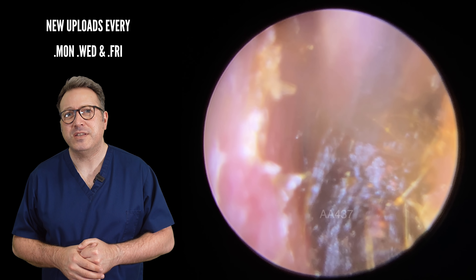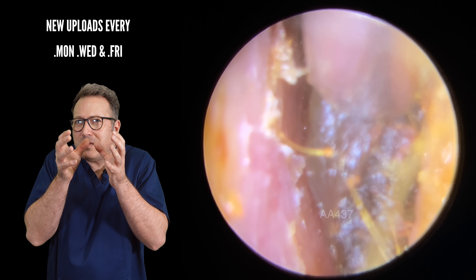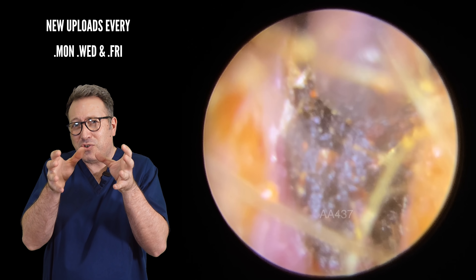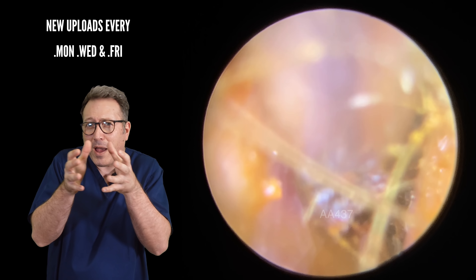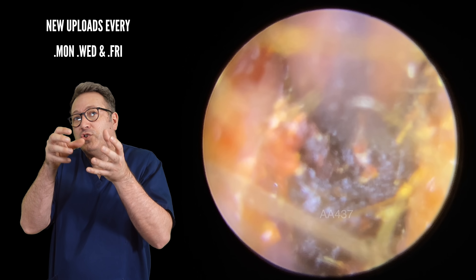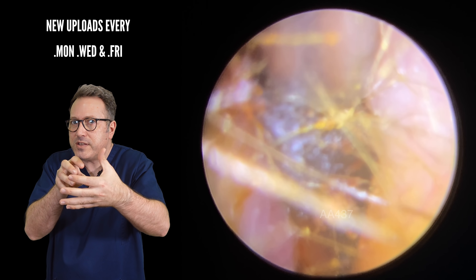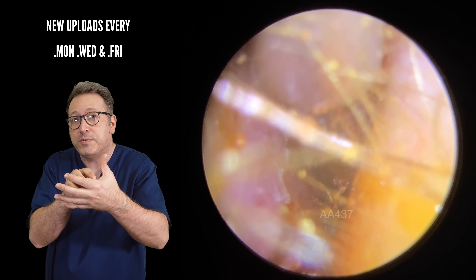Now this is where patience is the key. What you have to do here is tiny, minuscule movements — very, very slight wiggling — just to try and get this out. We're also trying to not only wiggle back and forth but draw down the canal at the same time. So we're trying to maintain the suction grip, hold on tight enough to move it back and forth, and also draw it down. You're always listening for the sound of the suction, because as soon as that suction grip breaks, you've got to go back on and get that good grip to bring it down the canal again.